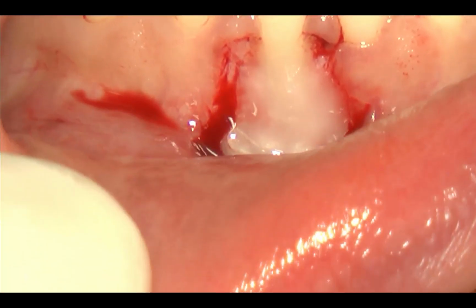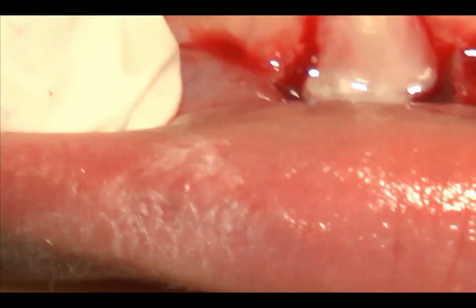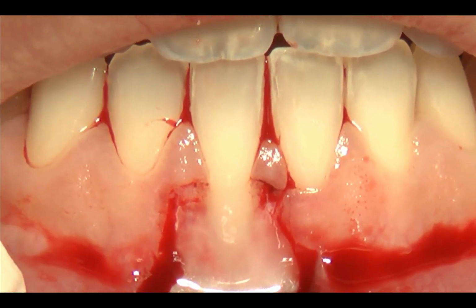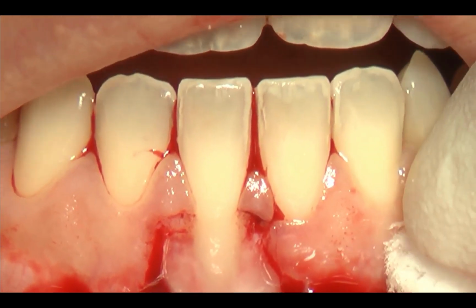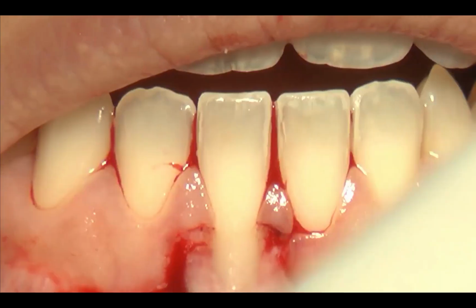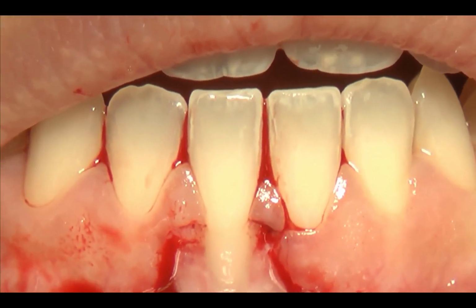During the time the gel does its work, we can start with the deepithelialization of the anatomic papillae. We take another knife, open slightly. Breathe in.